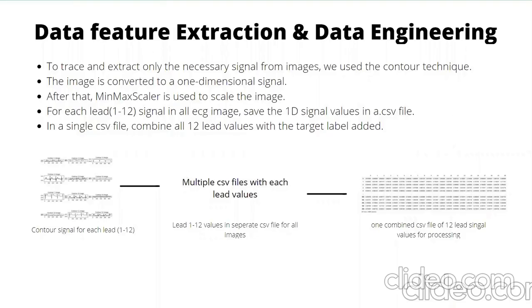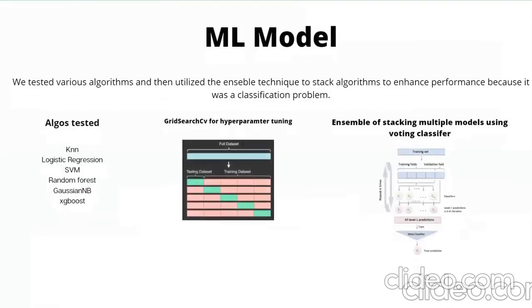Now Pooja will let you know about the ML model that was built, its architecture, and the deployment.